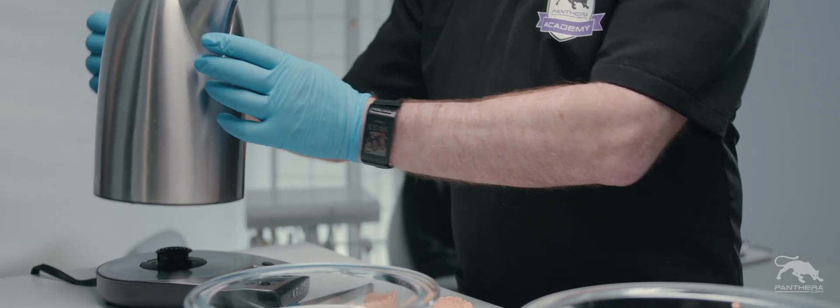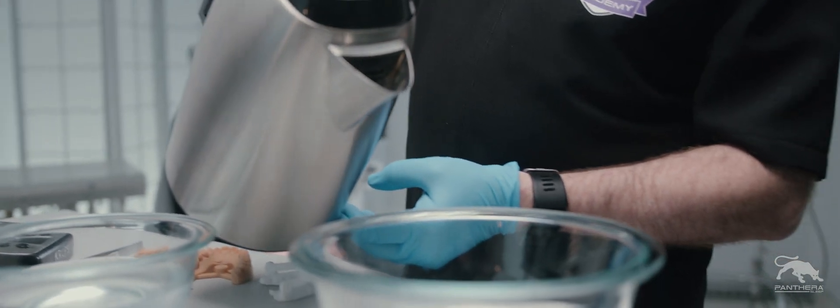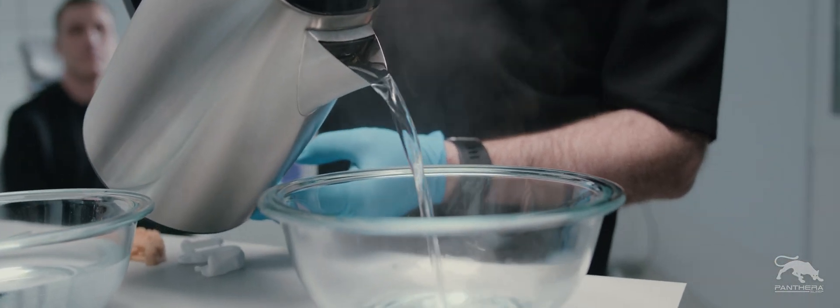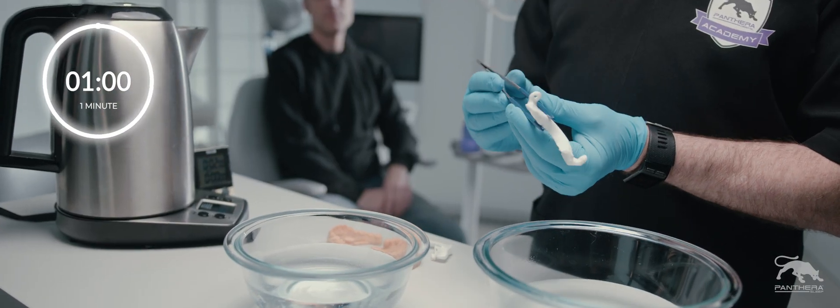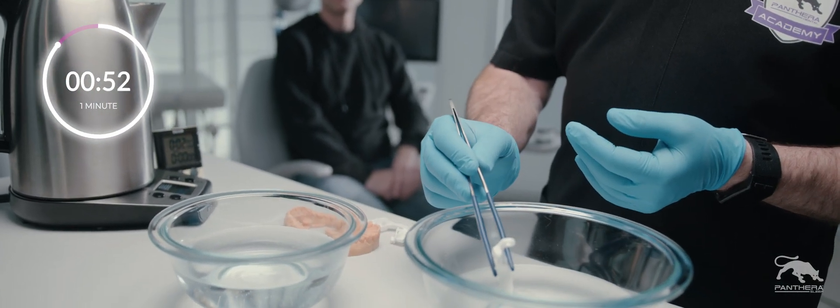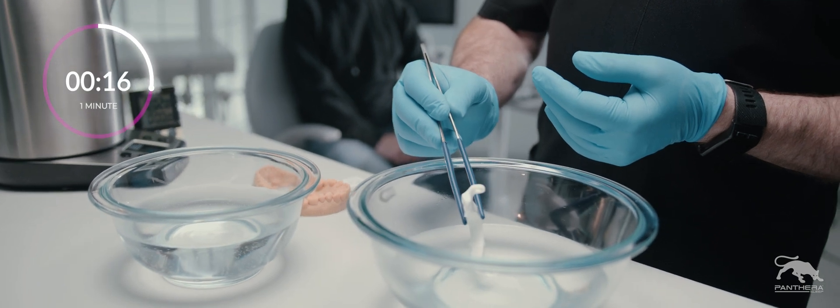Detach the rods from the oral appliance. Once the appropriate temperature is reached to slightly soften the appliance without risk of deformation, use pliers to dip the side of the splint that needs to be adjusted in hot water for about 1 minute.